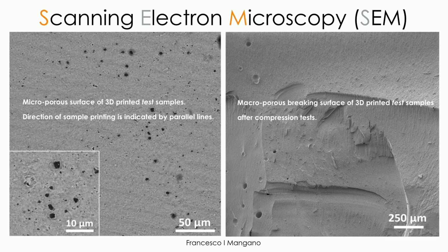And we can see inside some porosity, and probably the key to control the failure is to try to reduce or control this porosity, that is something unavoidable from one side if you print it. So in order to reduce this porosity, that of course doesn't exist with the milled sample, we can of course improve the printing process. But also we have to say that we can evaluate the behavior of the samples that underwent failure, and we can see the mechanical and the physical characteristics of these samples, and we found some very interesting points in favor of the 3D printed samples as well.